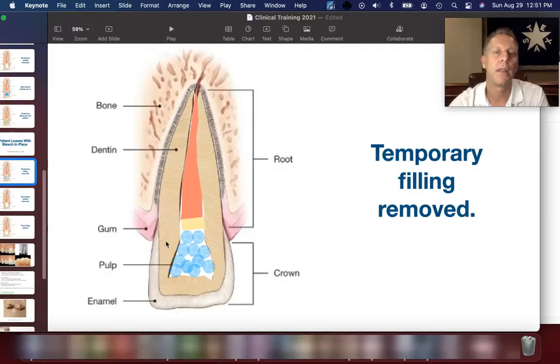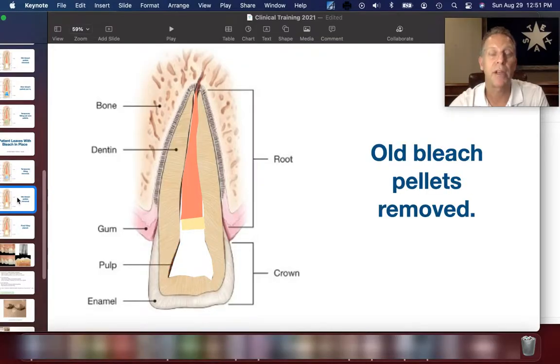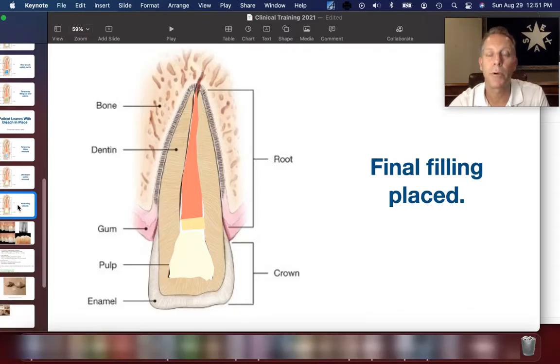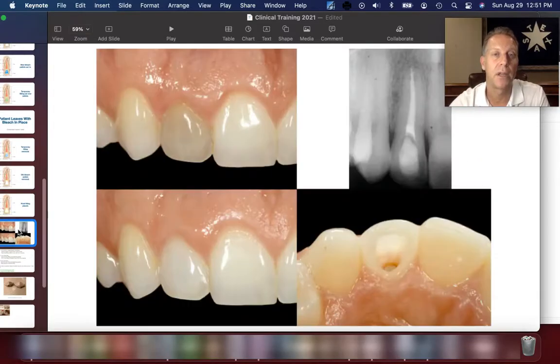At the third appointment, we take off the temporary filling, remove the old bleaching pellets, and now we have the cleaned-out inside hole of the tooth. We then put our final composite filling in place. On an x-ray, you're going to see a root canal that's filled up, the base material placed in, and then the final composite in place.